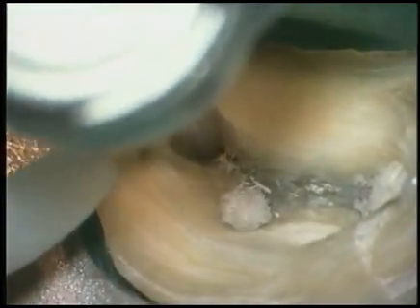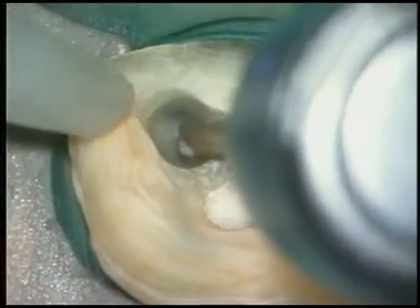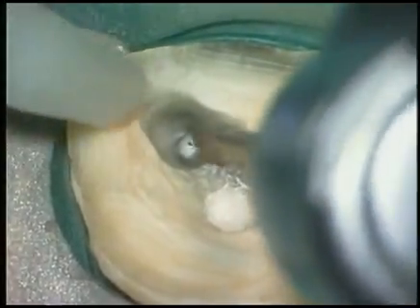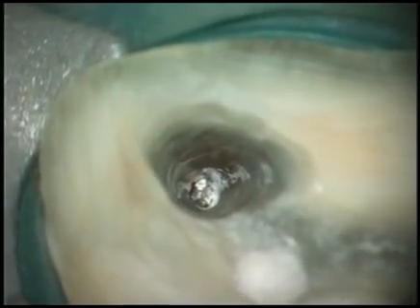Additionally, the belly of the bur can be used on the lateral aspect of the MB canal towards the MB2. This action begins to reveal the groove that typically road maps over to the MB2 orifice. GGs are used small to big, progressively stepping each larger GG out of the canal. This provides an excellent deep view of the broken obstruction.